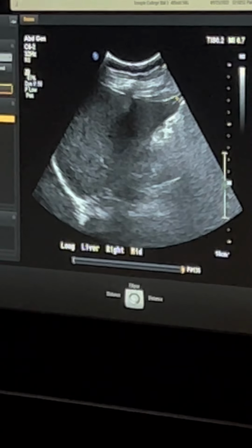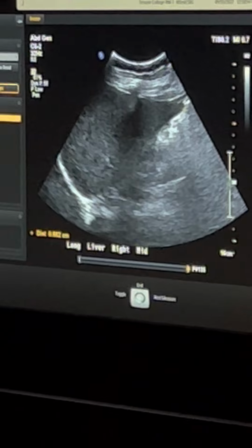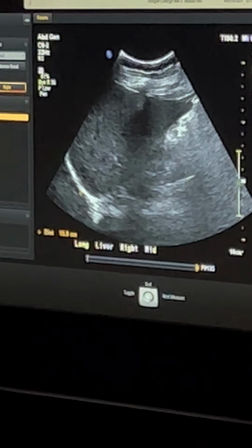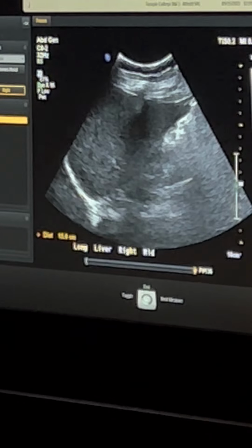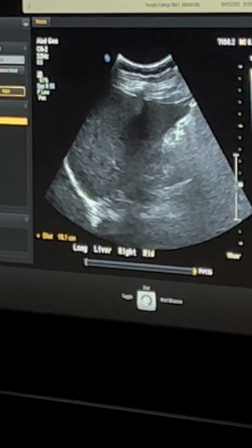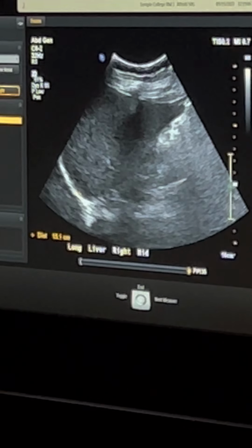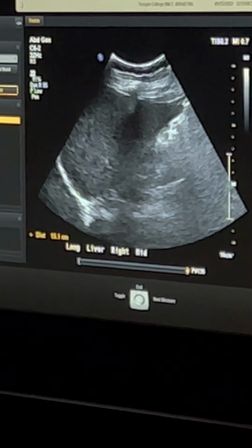So our measurement is gonna go from the very tip of the liver to the diaphragm. So not here because that is including the diaphragm. We want just liver, so it would be here. And you're gonna see people measure this all different ways, but how she's got those calipers up there, take note, that's correct.